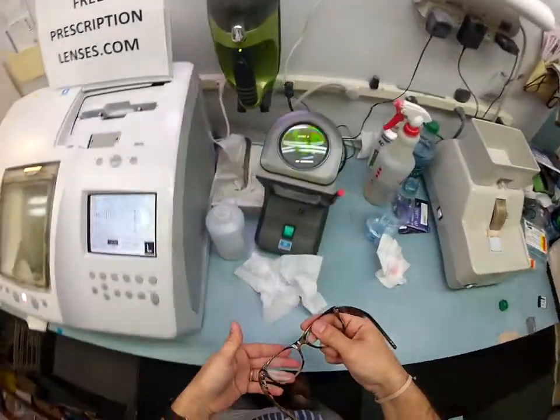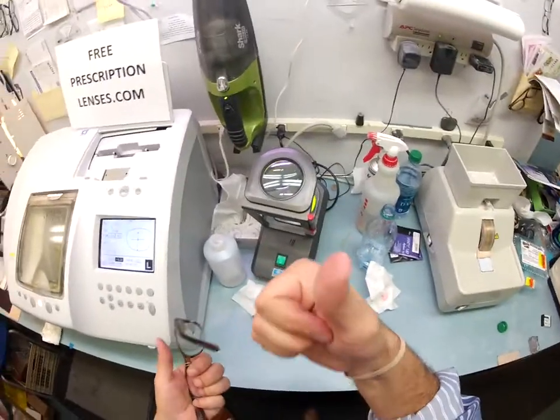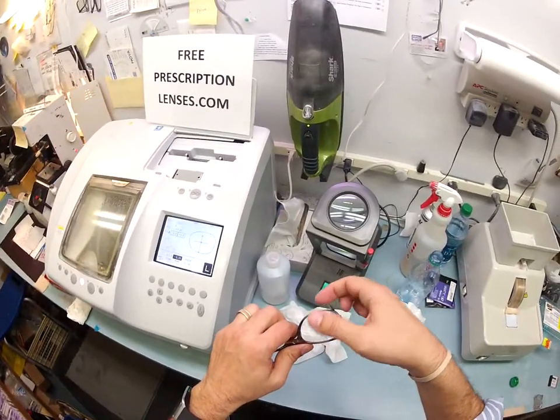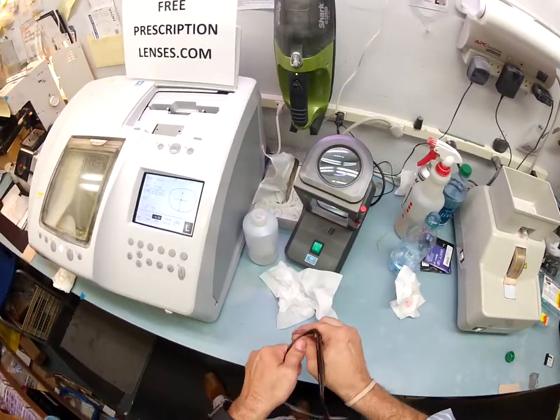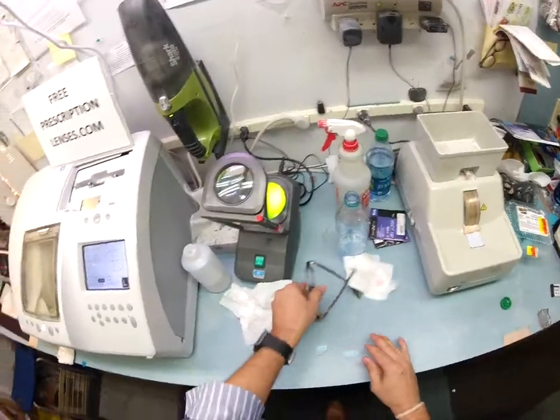To take them out, I turn the frame downward. I grab the frame with my left hand. You're always going to push down with your thumbs at the nose, even when you're mounting them. Thumbs down at the nose.